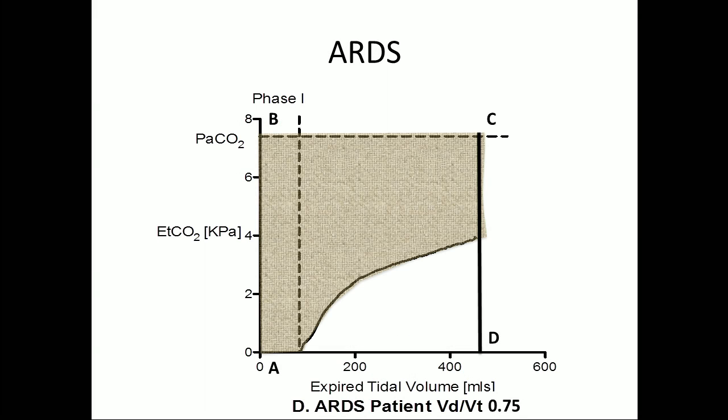We go to a patient with ARDS, and this shaded area is much bigger. And this is the basic principle, that we can use the CO2 waveform to work out what the physiological dead space is. Now, this work was done by Roger Fletcher, and he published in 1984 in the BJA. It's a seminal paper, and it's really progressed the technology, and increasingly we're using it more and more.